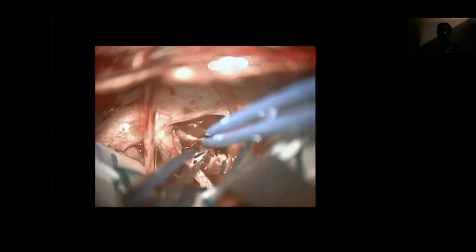Structurally, I think the optic abnormalities, yes? Yes, of course. But you have to find the good plane of the cleavage and the gliosis area. So this is a flattened chiasm, flattened like a chair. This is the back of the chair, and this is the seat itself. The plane will cut the chiasm. Absolutely, yes, it will cut it. So it's total removal. I'm checking here on the stalk and the others, to make sure that I have removed it completely. And hemostasis and so on.